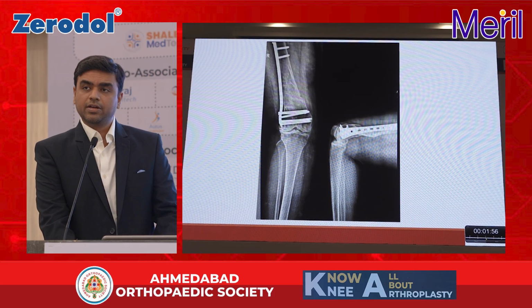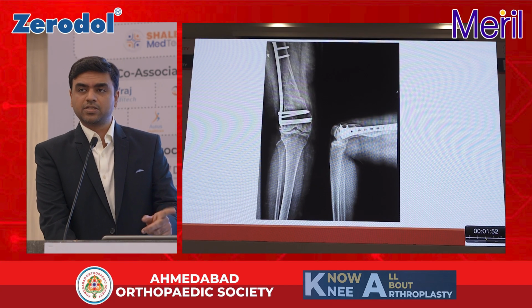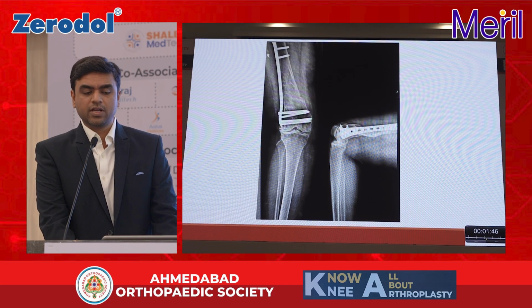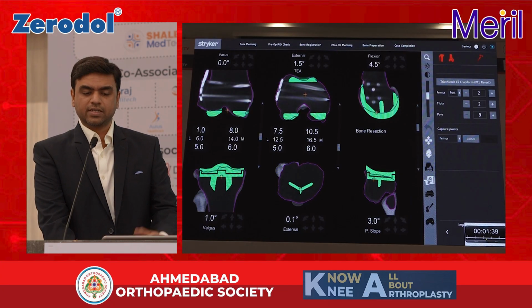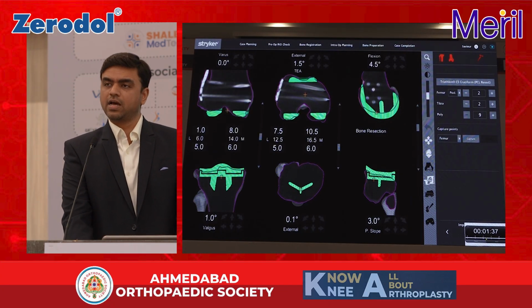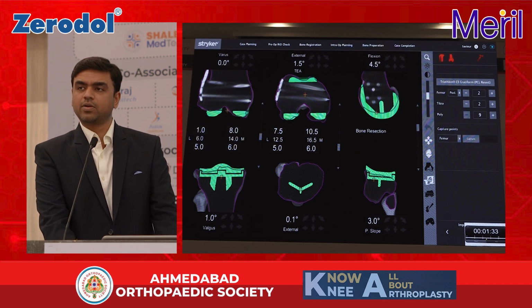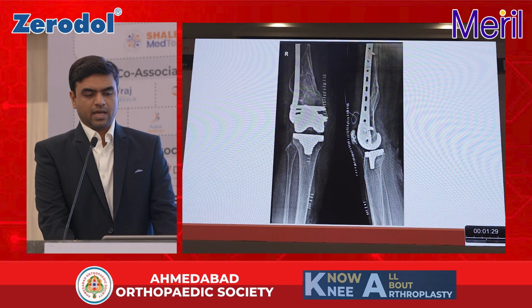So this is a rigid, uncorrectable valgus knee fixed a few years back. You can see on the lateral view the femur is malaligned. So even if you remove the plate and use an intramedullary rod for the femoral cut, that would also be tricky in such cases. Here we had the same experience, could get good analysis of the femoral hardware, did not remove a single screw, and got good outcomes.